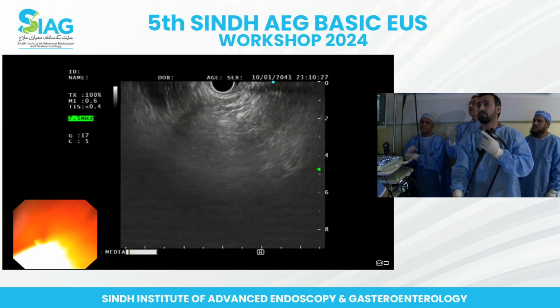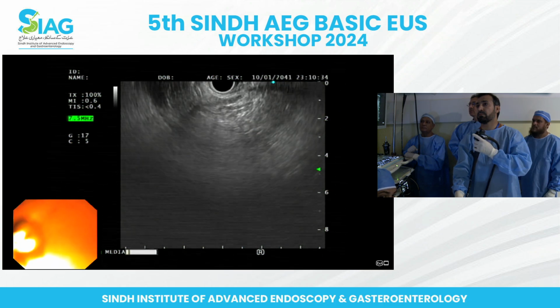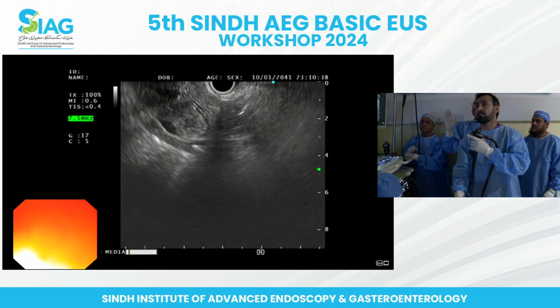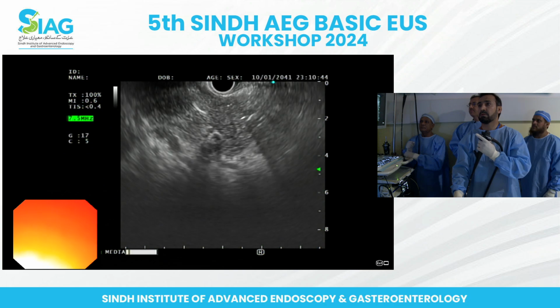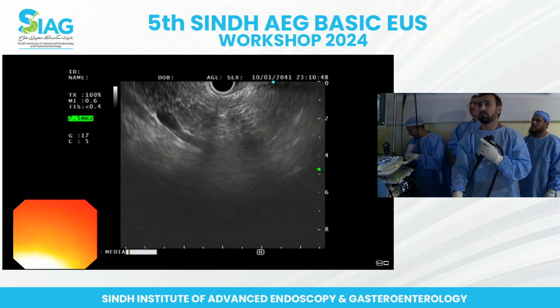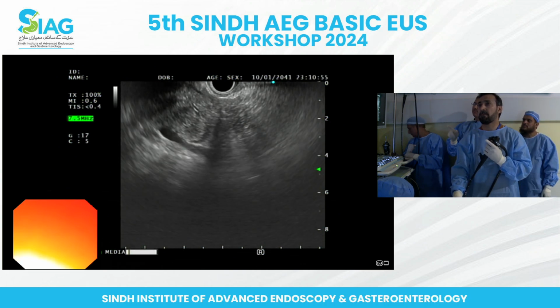Okay, good. Now you need to clarify these confluence. So big wheel slightly away from you now. Once you have seen the portal vein, concentrate on that portal vein. Right now you are going to random structuring. So random structuring in EUS, once you go into the random structuring, that means that you have lost yourself. So where is the portal vein? Go back to the portal vein.